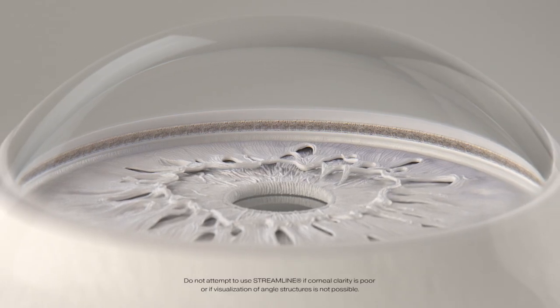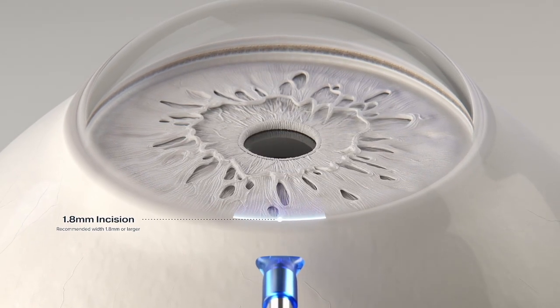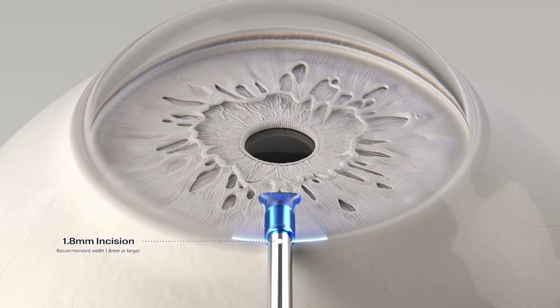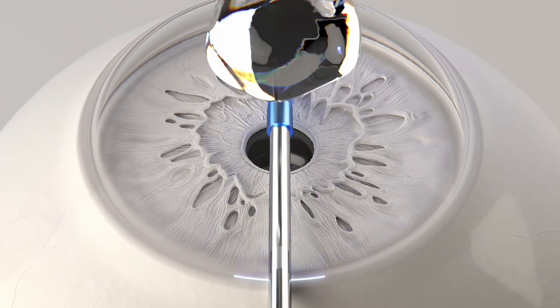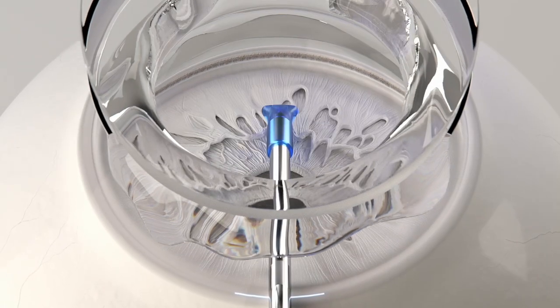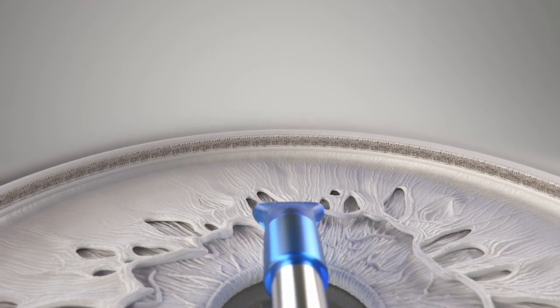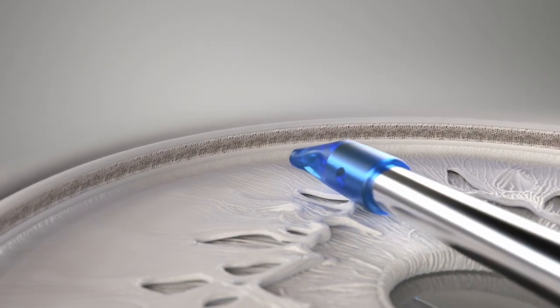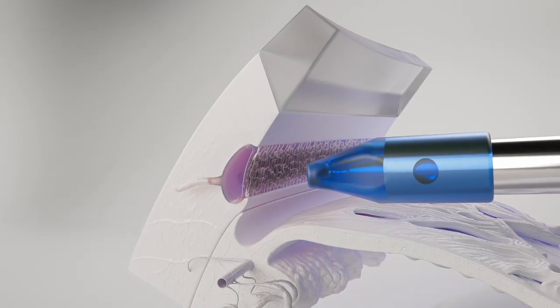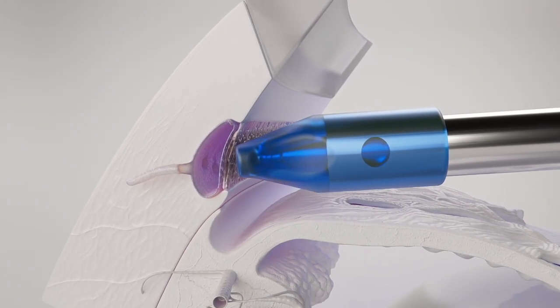Ensure a clear view of the anatomical structures, then insert the outer sleeve of the STREAMLINE Surgical System into the anterior chamber through an existing clear corneal incision, 1.8 millimeters or larger. Under direct gonioscopy, advance the STREAMLINE outer sleeve and locate the trabecular meshwork. With your hand stabilized, touch the outer sleeve against the trabecular meshwork to slightly applanate the TM without indenting the eye wall or losing view of anatomical structures.